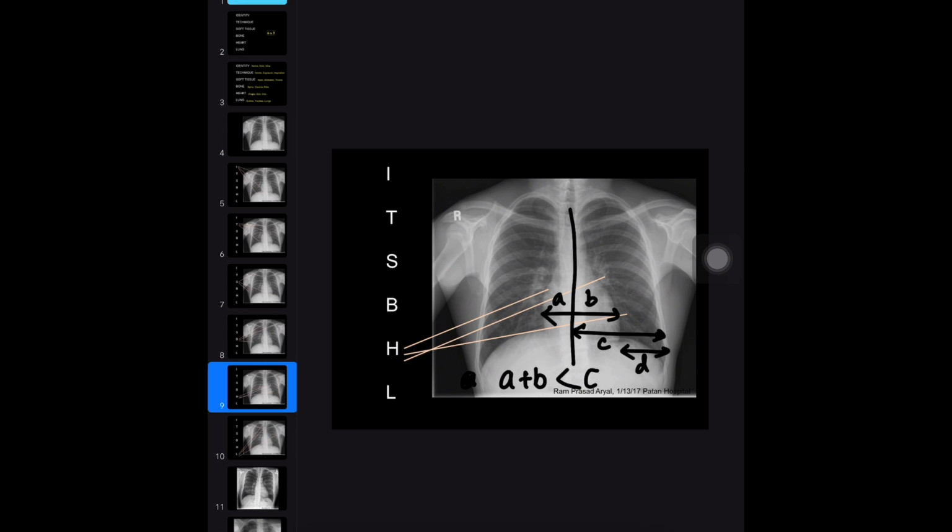That is the thing, okay. So if we consider this as E, then A plus B should be lesser than D plus E. So E and B are the same, so A plus B is lesser than D plus B. So B we cancel, so A is always lesser than D, okay.